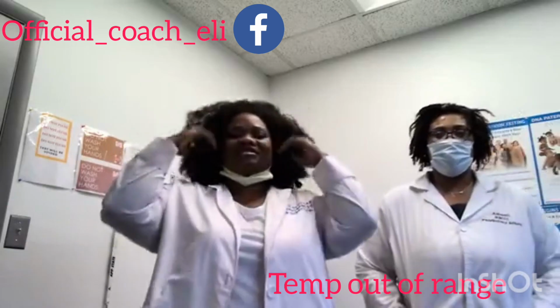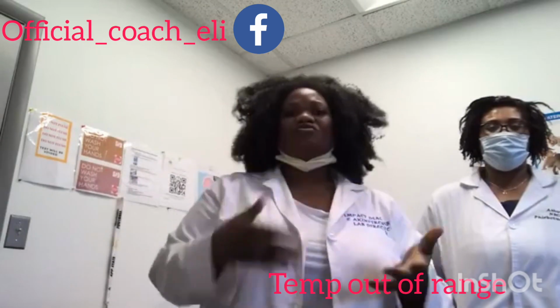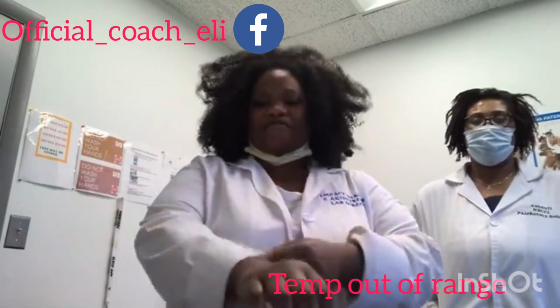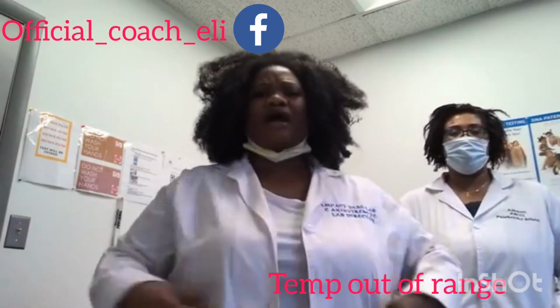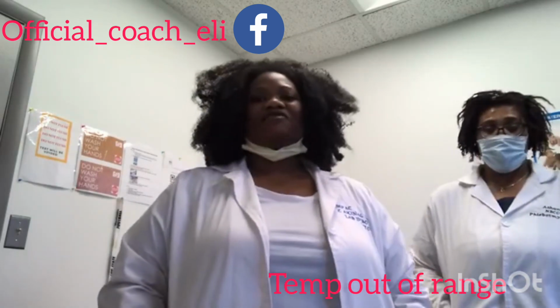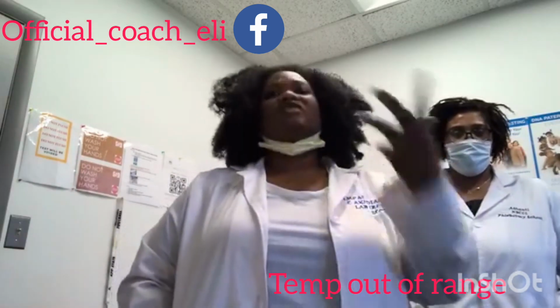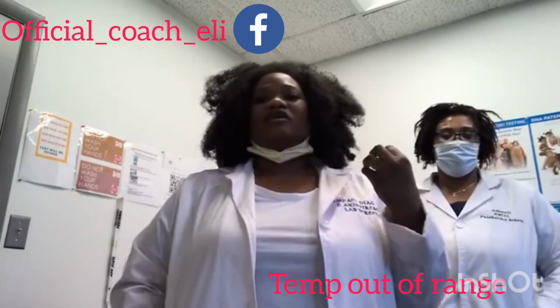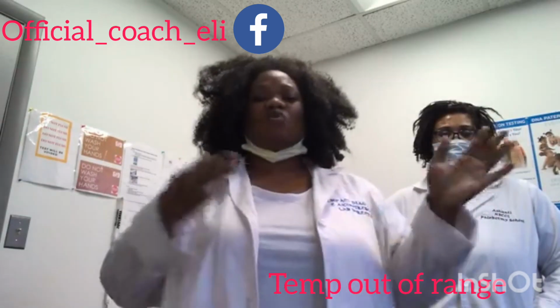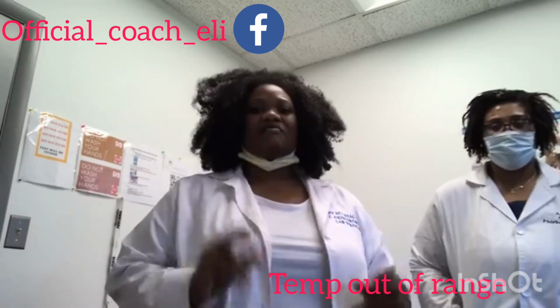Everyone, how are you? This is Coach Eli, and what I'm about to do today is show you how to properly do a temperature out of range. In my last video, I showed you how to do an uneventful collection. This video is going to be a temperature out of range. I want you to refer to this video so that you can get acquainted with how to do a temperature out of range. Remember, temperature out of range is one of the two tests that you're going to do, and that is because the first test was out of range.